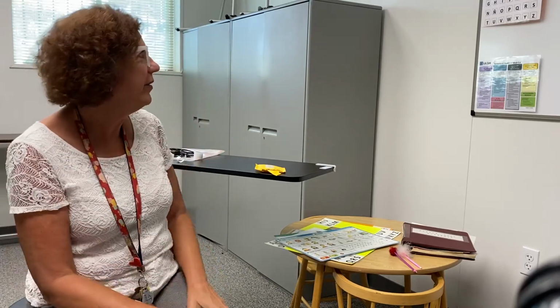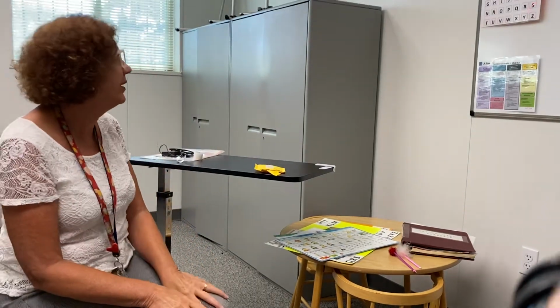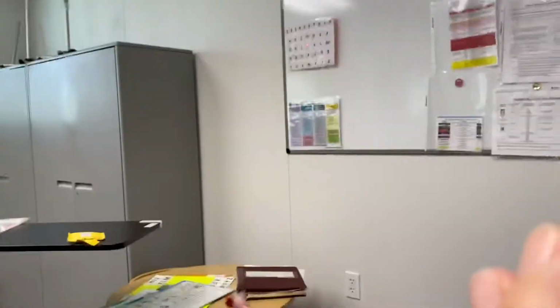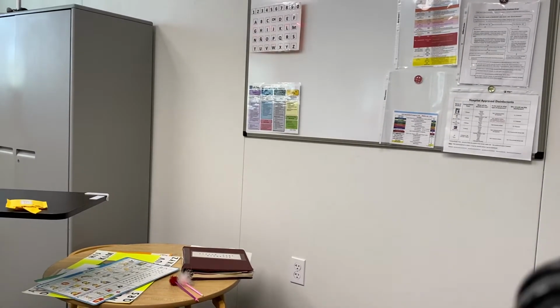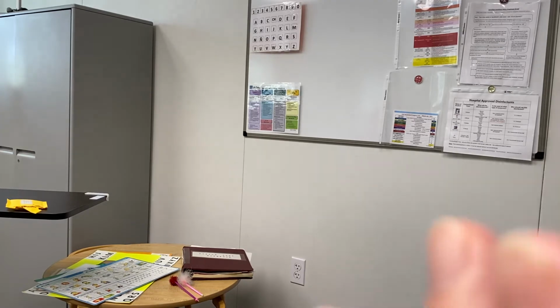I've also put an alphabet board up on the wall, and I can point to the letters with my laser pointer. So say again, I'm thirsty, I want something to drink, and I'm pointing W, A, T, E, R. Probably wouldn't even need to get past the A for the person to know what I wanted.